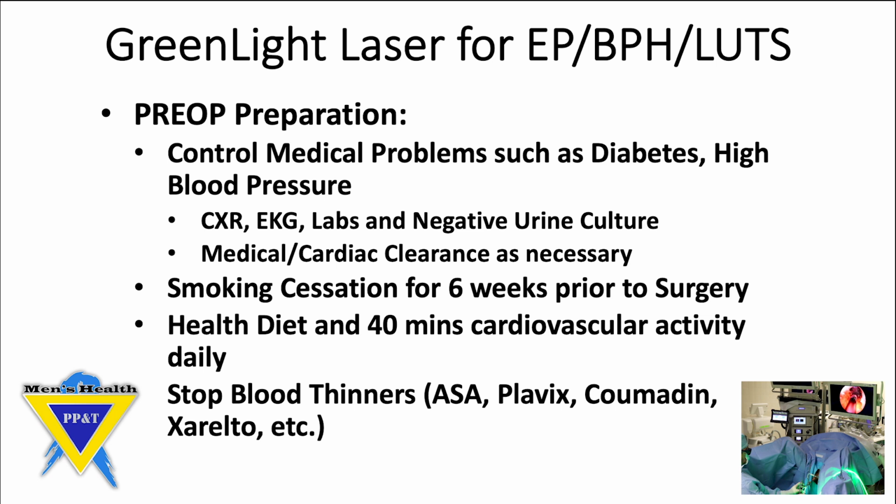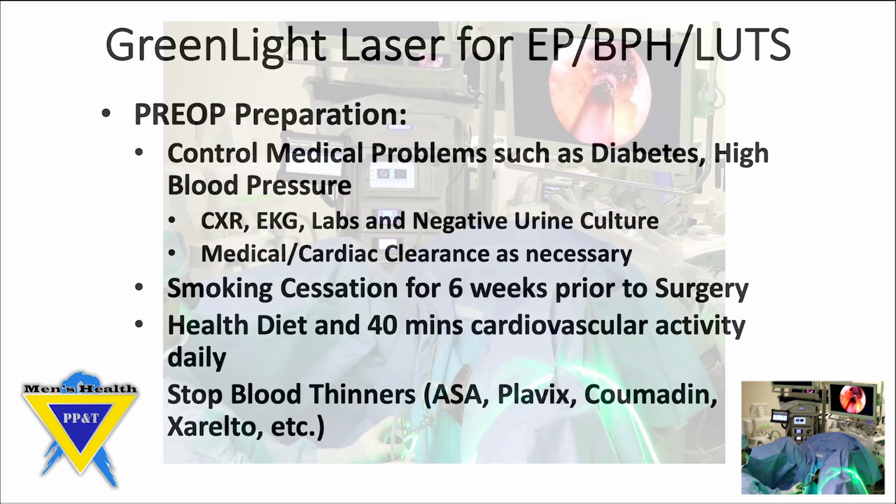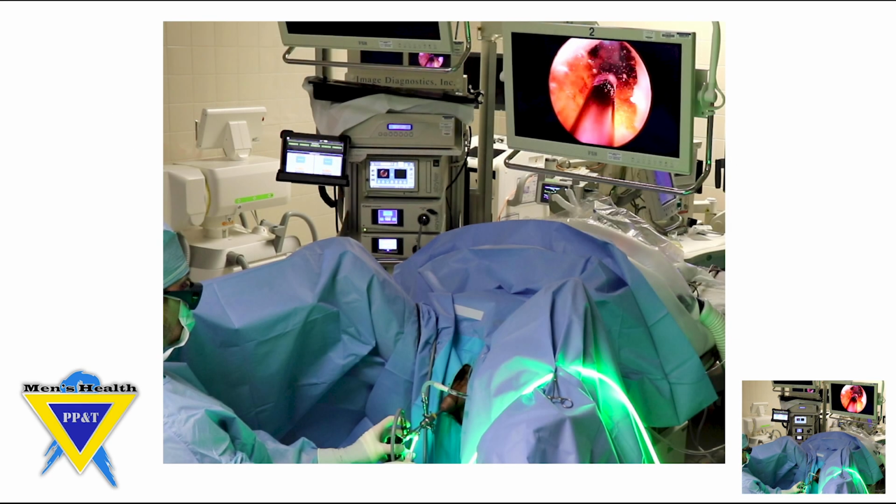In certain situations, we are able to continue blood thinners and still perform this procedure. This is the typical setup in the operating room.